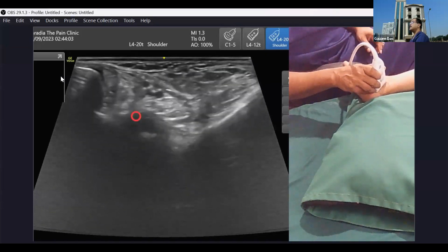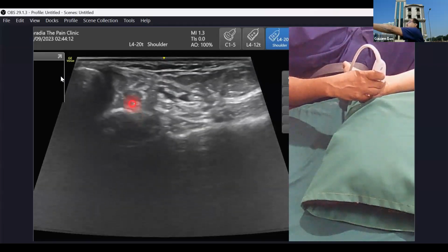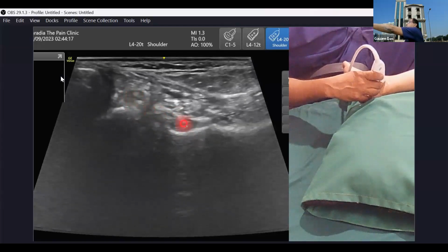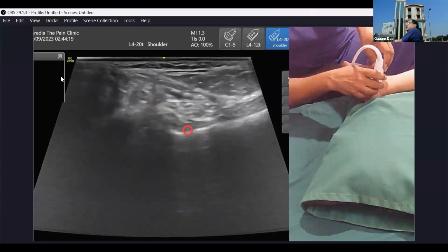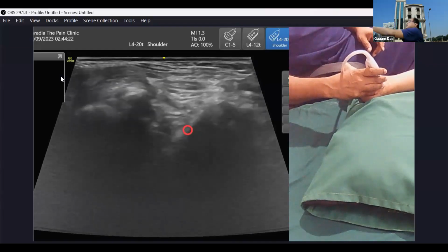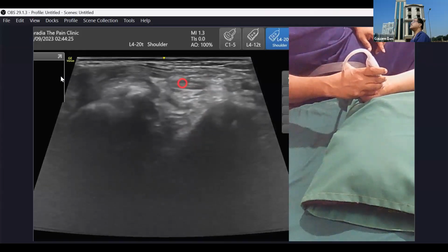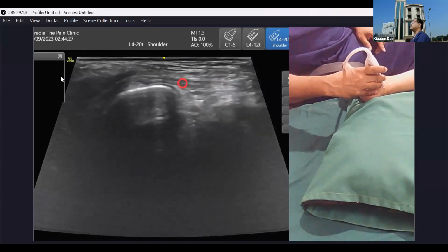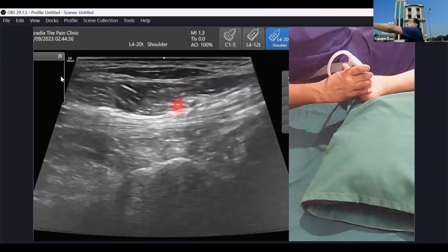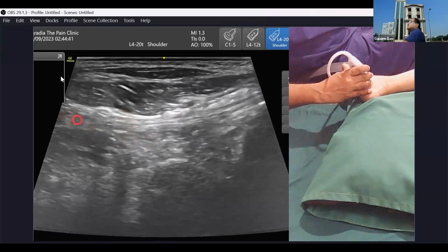Now look at the second one. Tom, Dick. Dick means flexor digitorum. So this was your flexor digitorum, and here was your flexor hallucis. So initially this is more anterior, this is posterior. Now when I'll be in the long axis, when I'll be seeing this tendon, follow this tendon. This is your flexor digitorum, and you see when I'm coming here, this is the flexor digitorum. So when I'm coming here, I can see both the tendons together. So flexor digitorum and the flexor hallucis. So one and one. And here is your knot of Henry.